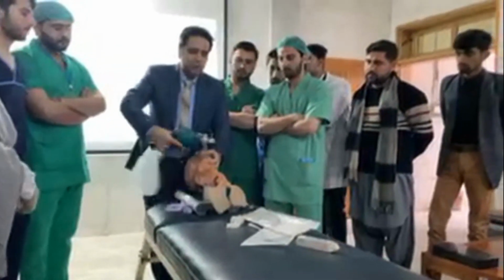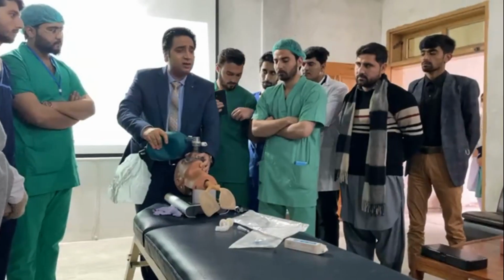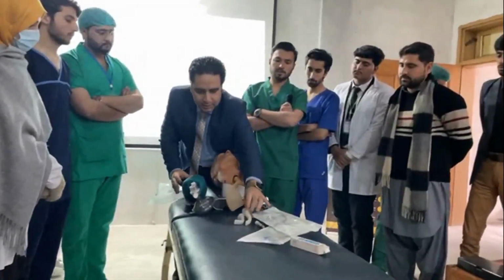When you oxygenate the patient, and you have pre-oxygenated, or if it's difficult to oxygenate the patient, what will you do? The second step is to place an airway. This is an airway.